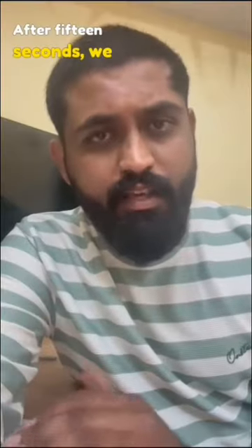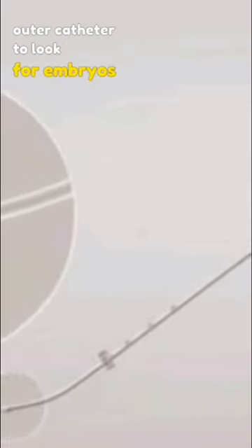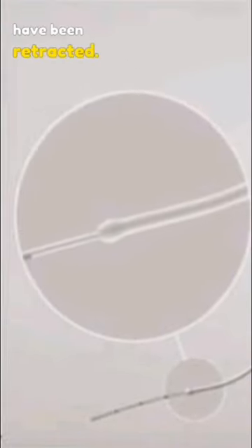Step 4. Retrieval. After 15 seconds, we rotate the inner catheter to a 180-degree angle and slowly remove the inner catheter. The outer catheter must be removed only after the inner catheter is half removed. Step 5. You flush the inner and the outer catheter to look for embryos that might have been retracted. And that is the end of a perfect embryo transfer.